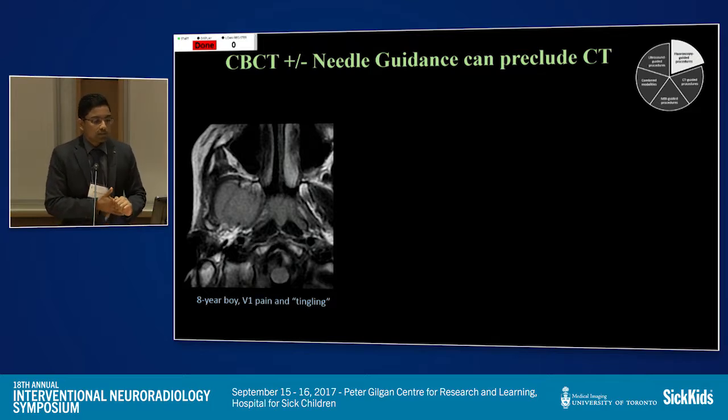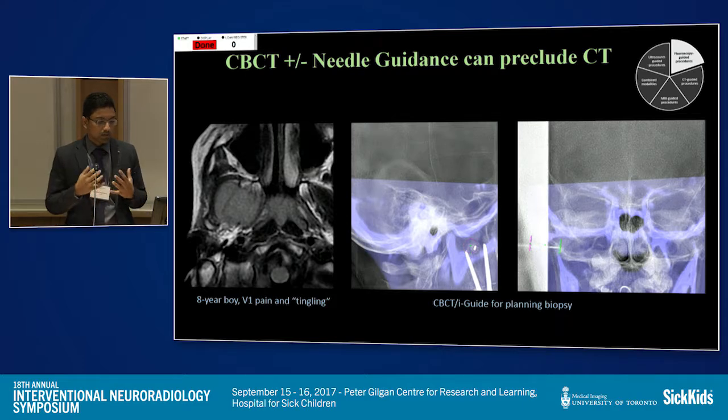I had spoken a little bit about needle guidance. I think Vitor was talking about cone beam earlier today. Needle guidance is a software that we use when we do a lot of these biopsies, especially for lesions that are well seen on CT. It allows you to target a lesion without having to do real-time CT guidance or multiple CT sections. The biopsy itself can be performed with biplane fluoroscopy, so we are using a live image.